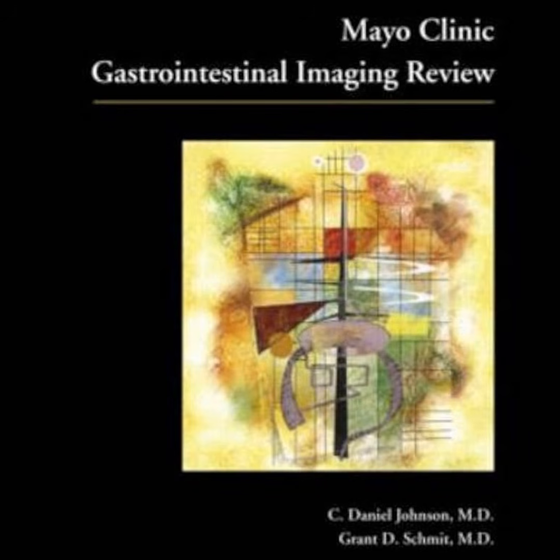So to reinforce that philosophy and everything you've learned today, we have a quick clinical vignette for you, the listener, to solve. You are looking at a contrast-enhanced CT of an elderly patient presenting with acute abdominal pain. You identify a circumferentially thickened colonic wall, localized specifically around the splenic flexure, and you spot portal venous gas tracking up toward the liver. What is the most likely diagnosis, and what is the underlying physiological mechanism?